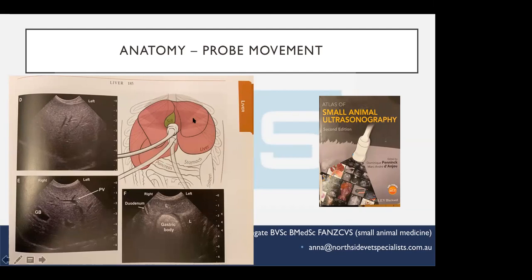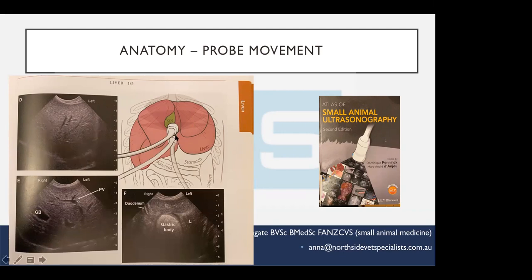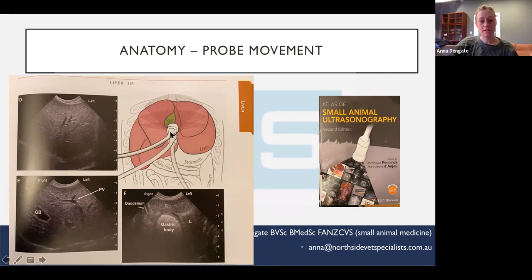The reason I asked that was because you talked before about the fact that if you wanted your liver all off to the left, and if you had anything to the right, then you knew that the liver was enlarged. I'm still struggling with that a little bit. Oh, right. Okay, sure. Because in this view, that's not going to tell you how much of the liver is cranial, how much is caudal. It's going to tell you how much is right and left, right?